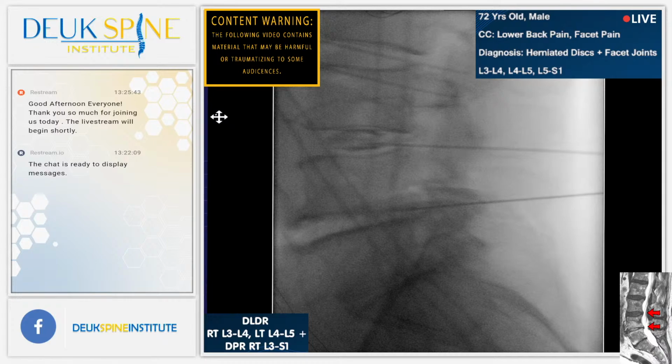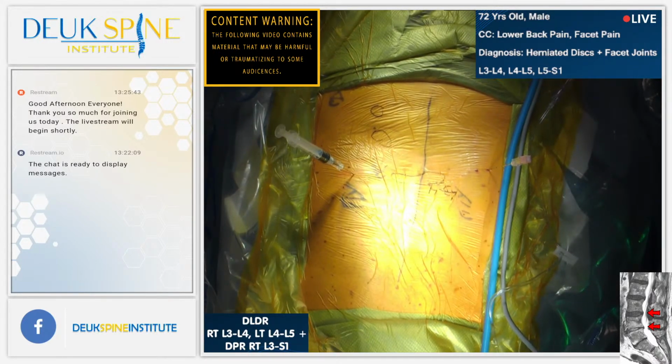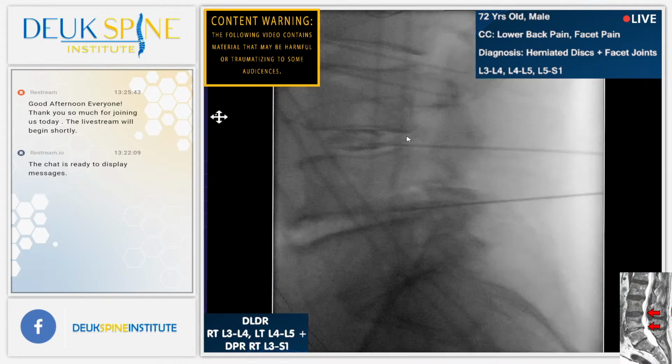You didn't feel much. All right. You can see the herniation there on the side view. Show us the herniation. Are you going to show us? That's not it. You don't see it arching up? Yep, that's it. Okay? So he's got right leg symptoms. We're going to go in there, and we're ready to put him to sleep, by the way. We're going to go in there and remove the herniation, pinching the nerve.